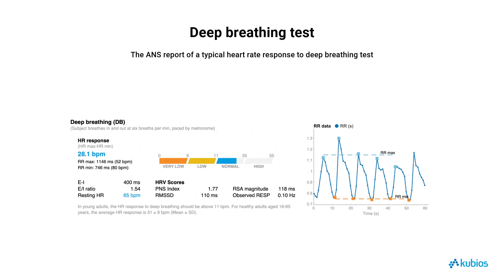To evaluate the heart rate response to deep breathing, we identify the longest RR interval at the end of expiration and the shortest RR interval at the end of inspiration. These intervals are then averaged across the respiratory cycles performed during the challenge. The heart rate response is quantified as the difference between the maximum and minimum heart rates, expressed in beats per minute, calculated from the averaged RR interval extrema points. Alternatively, the response can be reported as the difference or the ratio between the averaged RR interval extrema.